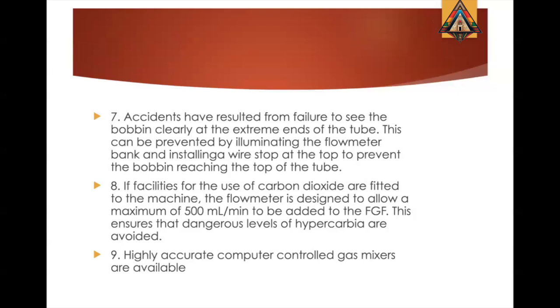Now everything is controlled, everything is digitalized, in a very modern and new anesthesia machine. There's no actual bobbin, it's all electronic.